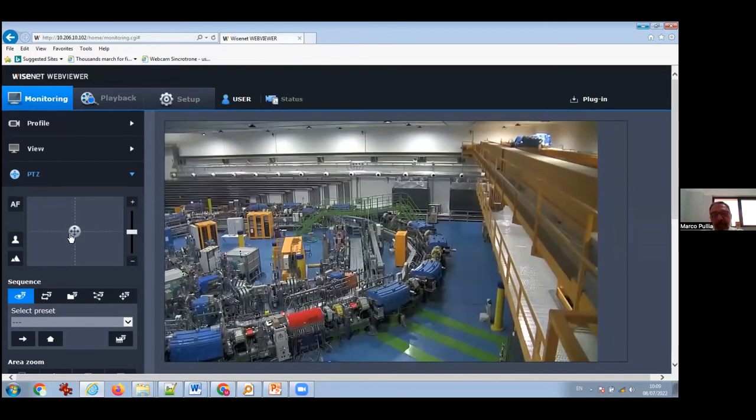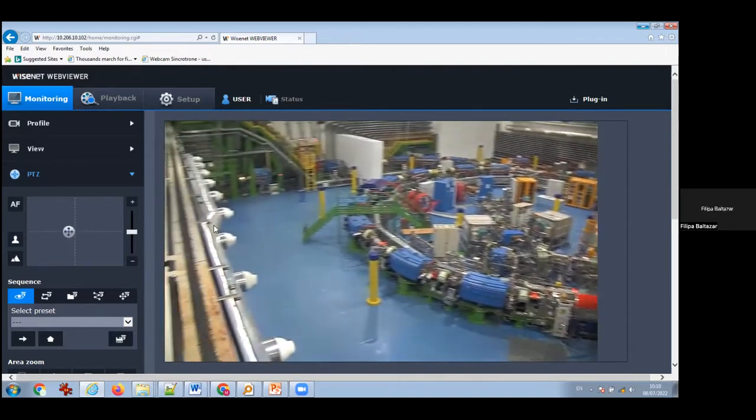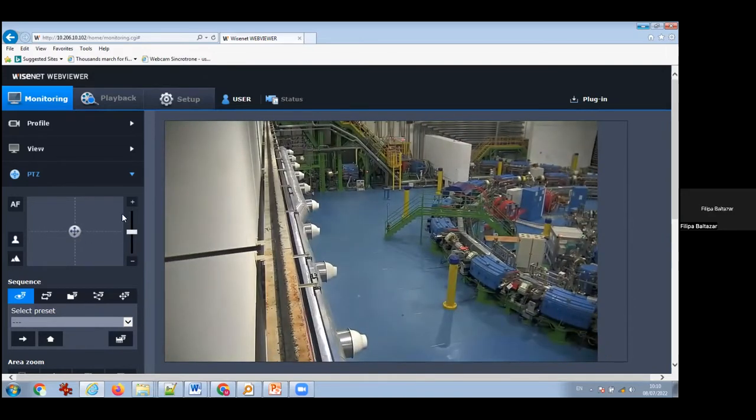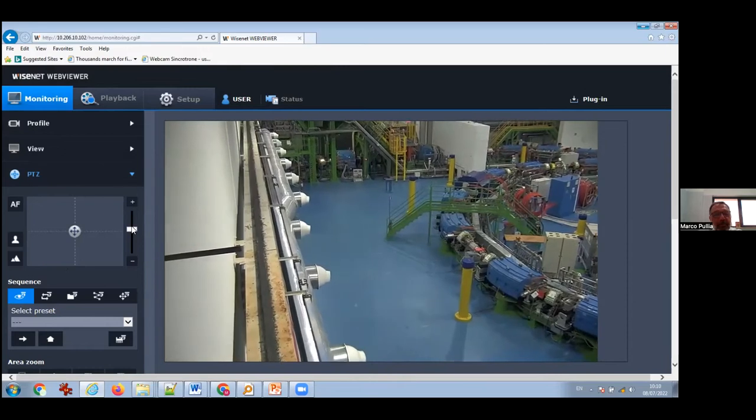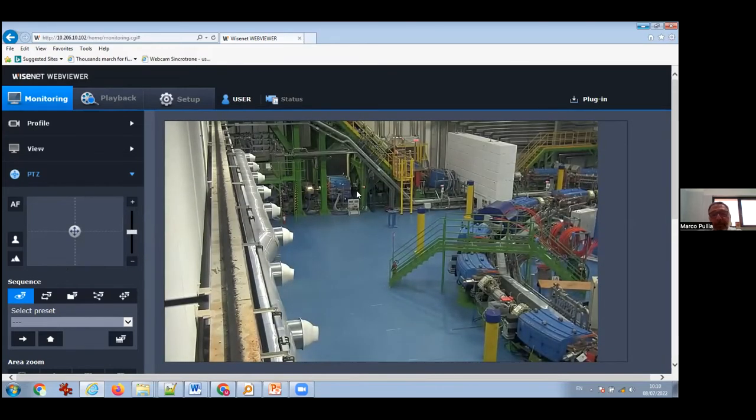They were prefabricated outside and then brought in with the truck. You can imagine a truck with a 37 meter beam on it. The truck was coming in from this door there with the beam on it, with 10 centimeters on the left, 10 centimeters on the right, more or less, of space.